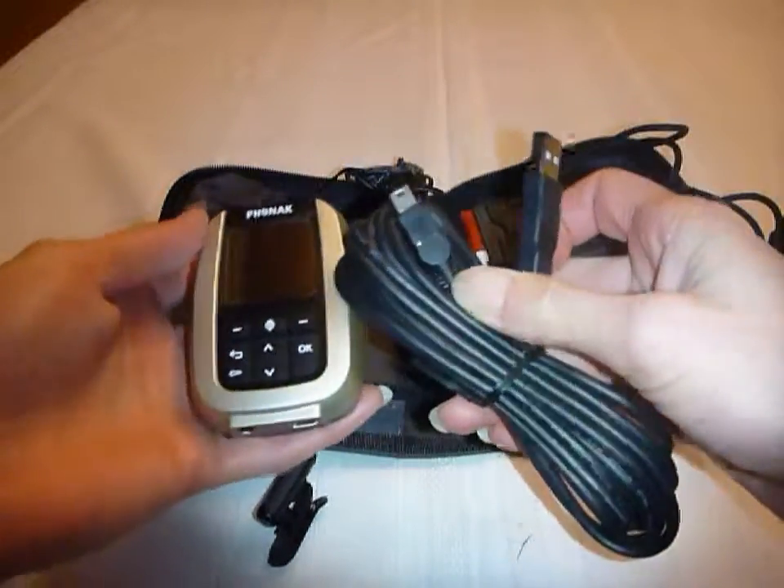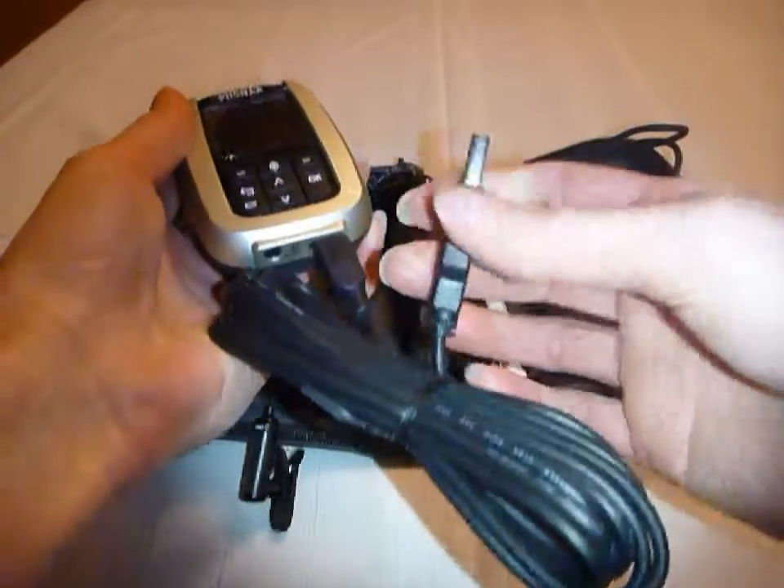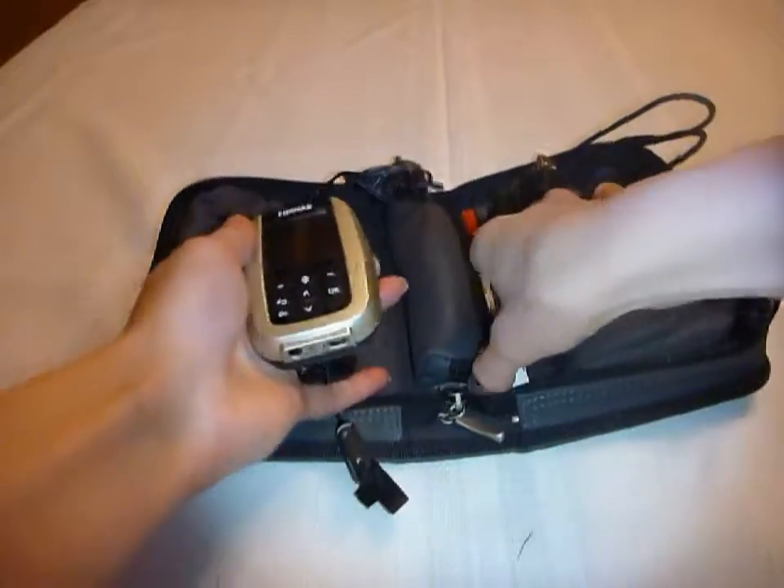There's also the computer cable, so you hook the transmitter up and you can plug it into the USB port on your computer to collect the data.